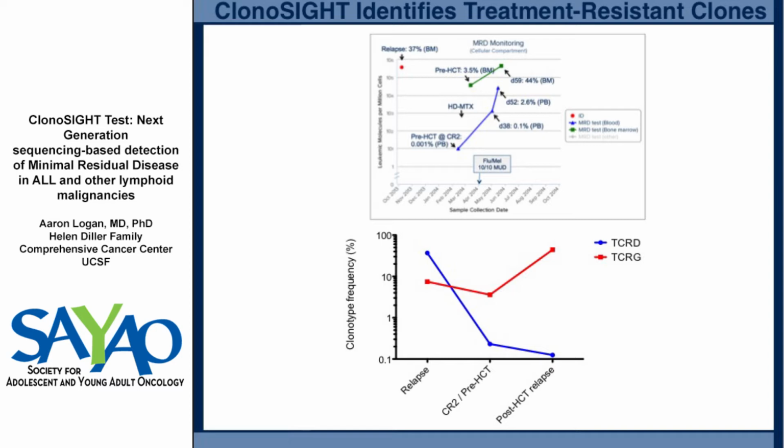So this is some aspect of disease biology that's being unveiled by this multi-receptor sequencing platform that you can't get from flow cytometry, you can't get from ASO-PCR. This definitely needs further exploration because maybe we need to achieve a certain debulking for all clones that are present in the disease in order to have good outcomes from transplant. So that's just food for thought about how this can grow into something more.